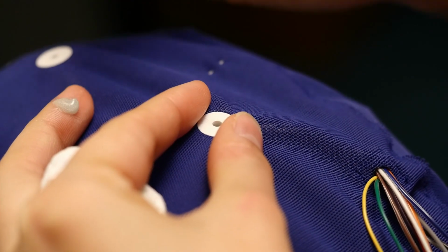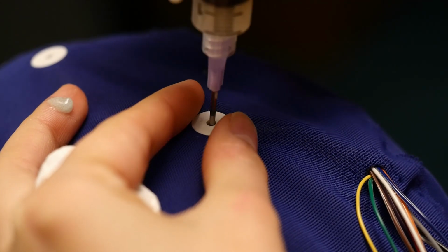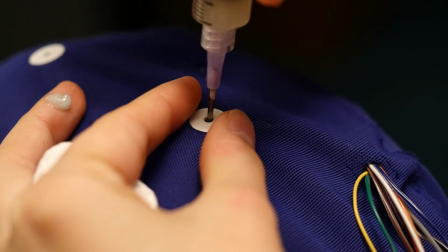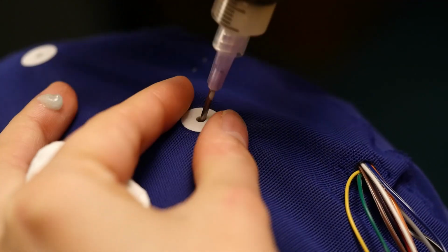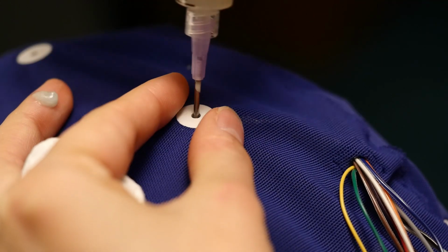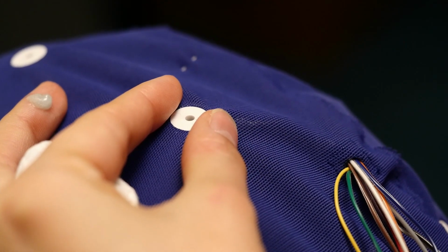So now I'm going to take my syringe or my dowel and I'm going to put a little bit of New Prep on, and then I'm going to combine this with our last practice there, the circle. So we're going to make a nice large diameter circle, and hopefully that New Prep will further help to break down any oils or residue that is still left on the scalp and causing problems with your connection.